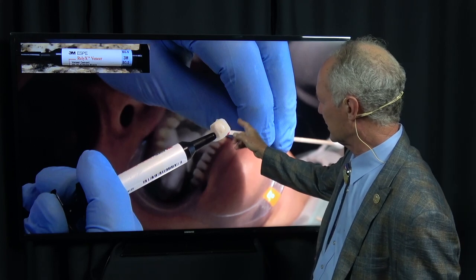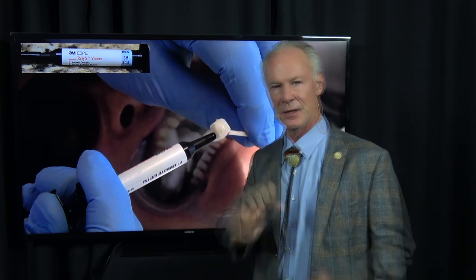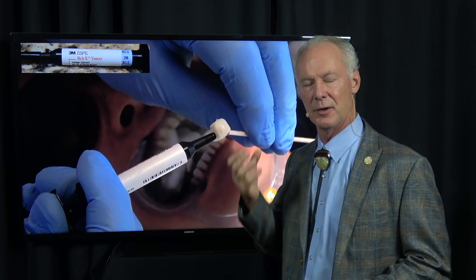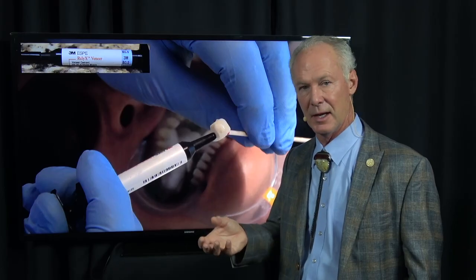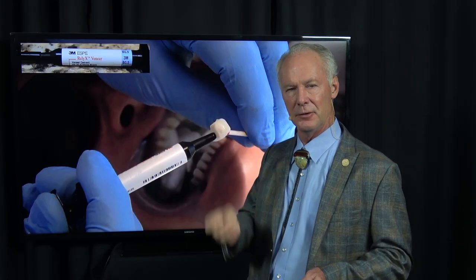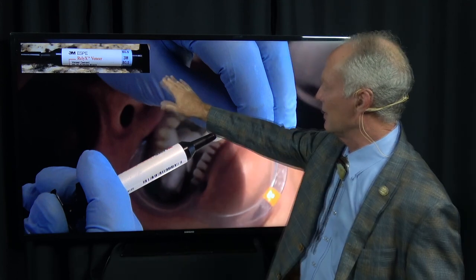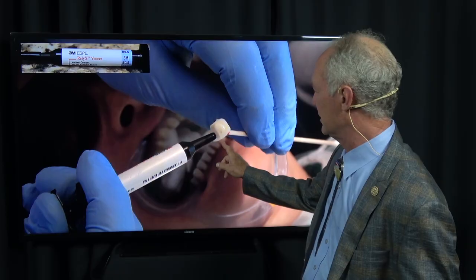Then I'm going to place the filled resin in the veneers. This is Rely-X Veneer - I've never used anything but that since the 80s. It's wonderful. You don't want a thick or highly viscous cement or it won't seat. You want a veneer cement. There was a time people advocated using highly filled resin like Herculite to seat veneers - that doesn't work. You want a low-viscosity filled resin, and this Rely-X is fantastic. This is shade B0.5.